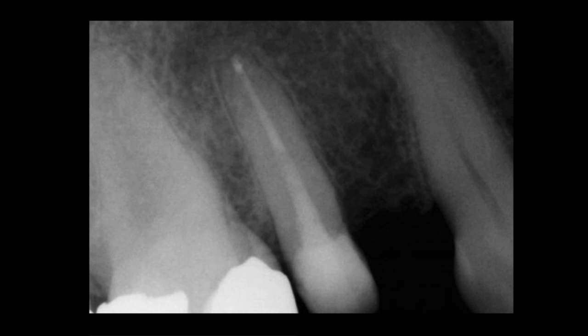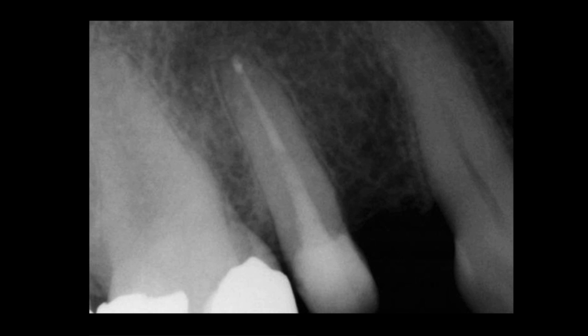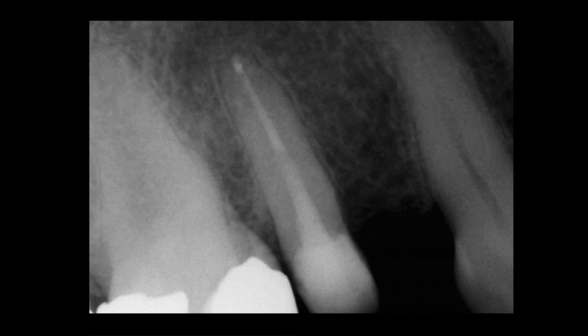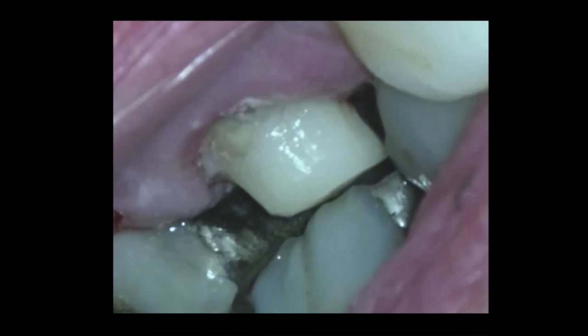The final radiograph shows the tooth with the post, core material, and the apicoectomy site at the end of the roots. You can see how the post matches right at the gutta-percha point. Crown lengthening creates a better ferrule, and having a long root helps significantly. When there is no high friction from the adjacent molar, the prognosis is favorable. Here is the case after healing and preparation — the tooth is ready to be restored.